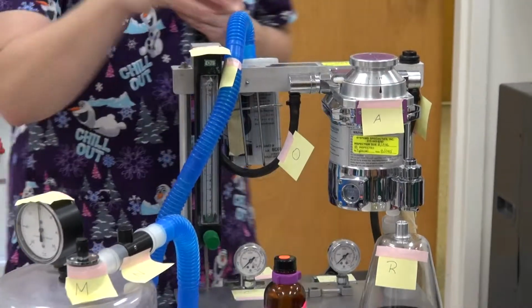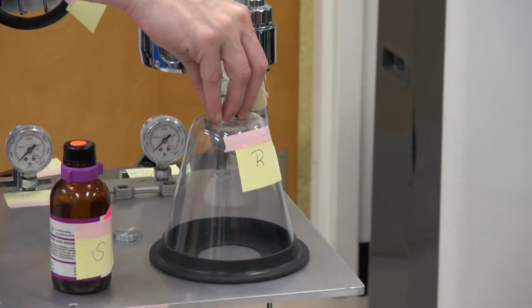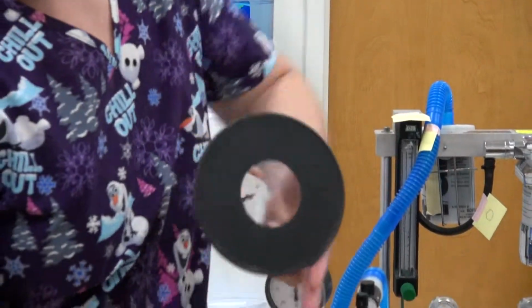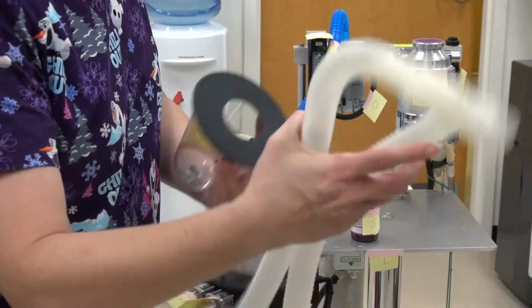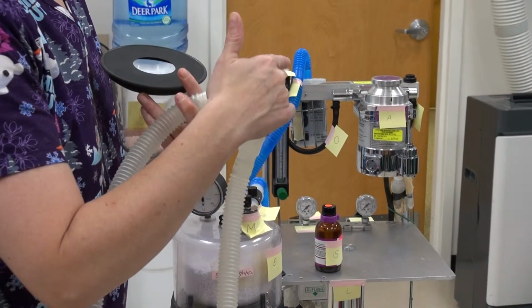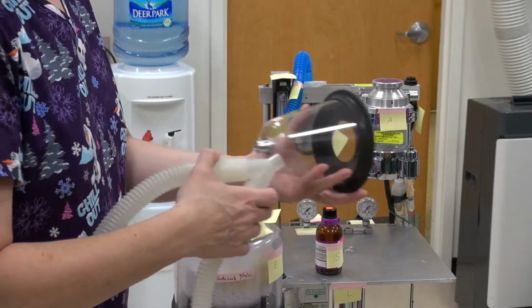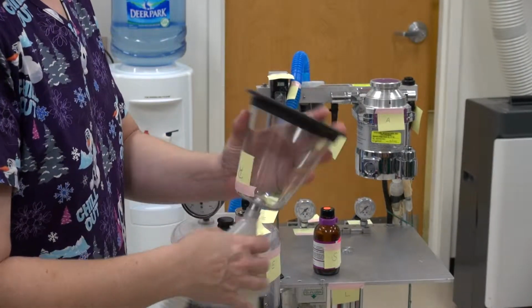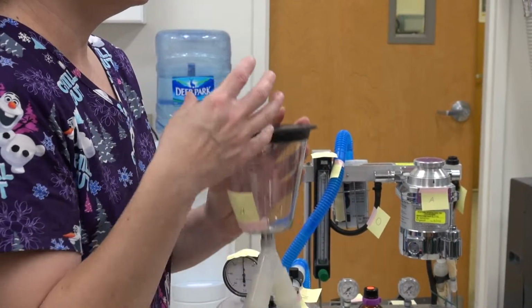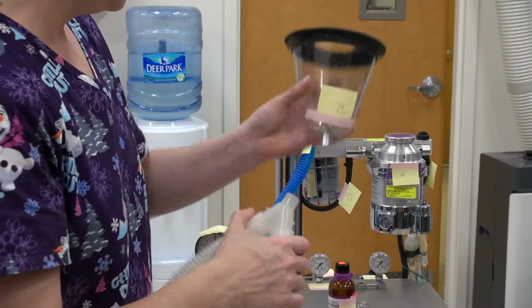What is R here? Breathing mask. Anesthesia mask. That's our breathing mask, which can easily hook to our tubes. And what is this called, guys, right here? That's our Y connector, okay? And that is going to hook to the mask. You're going to be able to put it on the patient, and the patient's going to be able to inhale either pure oxygen or mixture, depending on what you need to do.